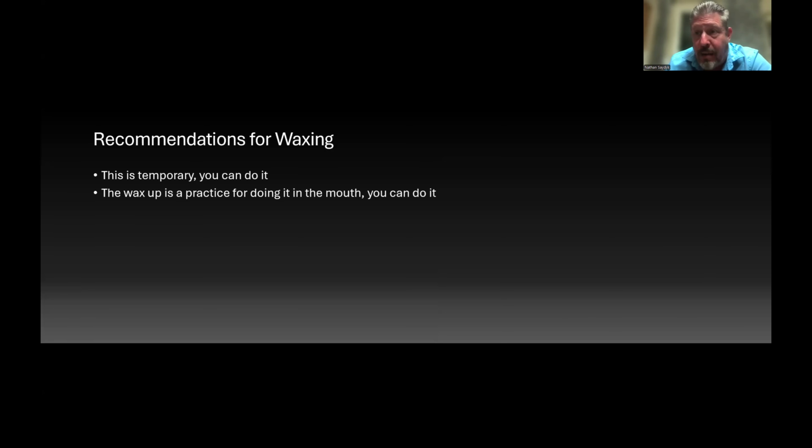You figure out the problems, right? You know where it's supposed to be. If you do it in wax first, you know what it's supposed to look like. You did it. Incisal edges are the most important part. You can do incisal edges. You don't have to make it look good. You just need to get basic shapes right and then polish it because they're going into ortho.